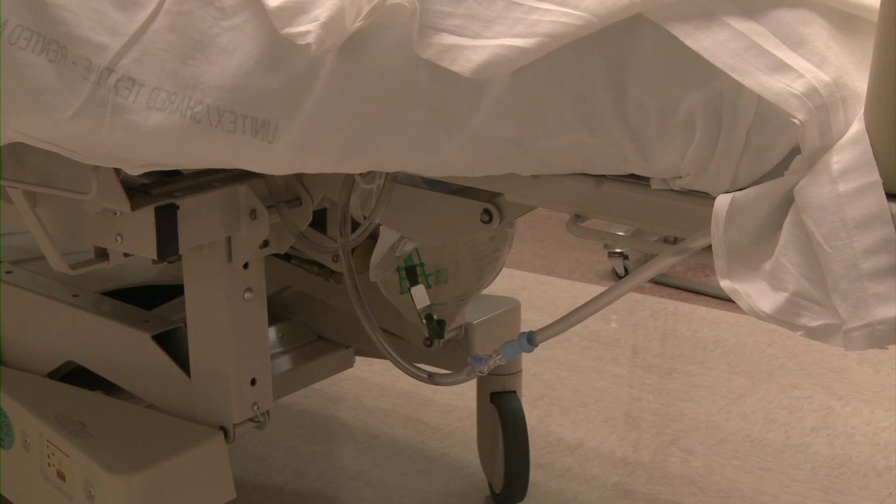So if it looks like we're trying to hide it from you, we are, because it's not integral to your simulation. Each mannequin has lifelike genitalia and a urinary bladder that can be catheterized. So if you are concerned that your patient has a Foley catheter, the best place to look for that is at the genitals and not at the undercarriage of the bed.